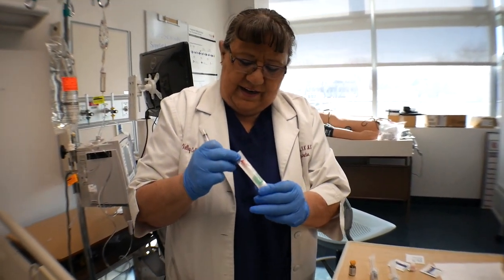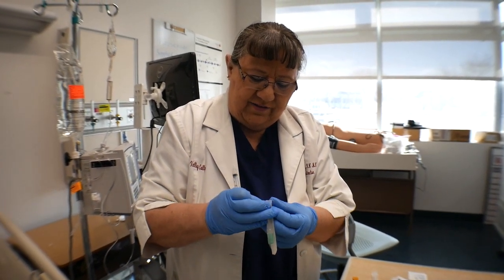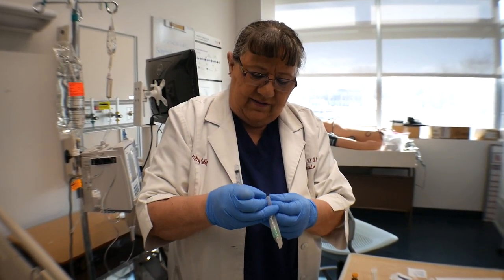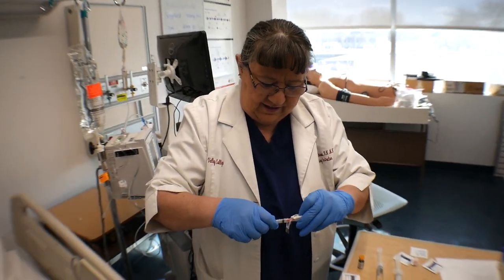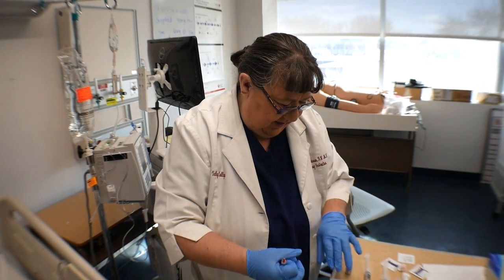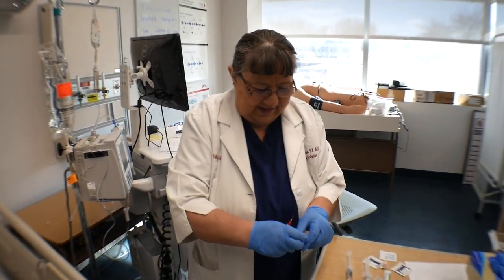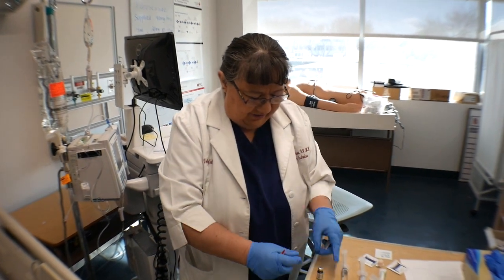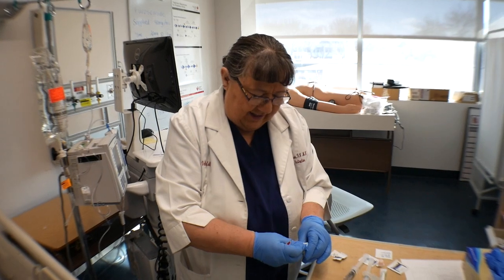So with these syringes, you use the red side to draw out of the vial. So you need to put this on, pull this out. So even though this is brand new, I still need to look at it again, take it off, and I need to swab it for 15 seconds.